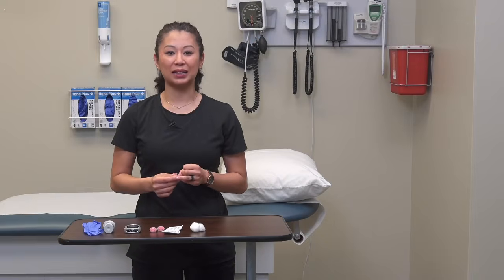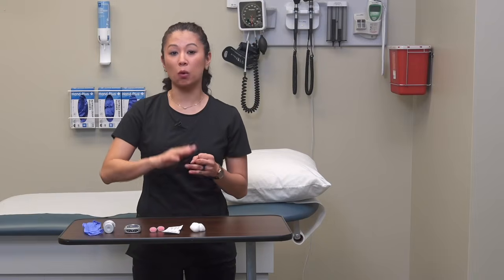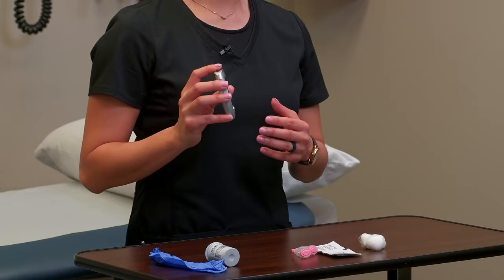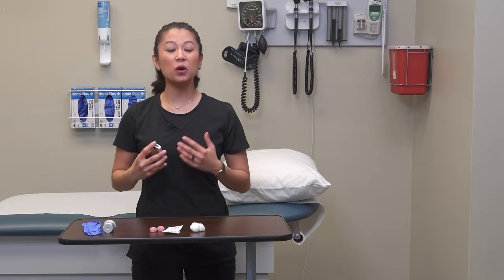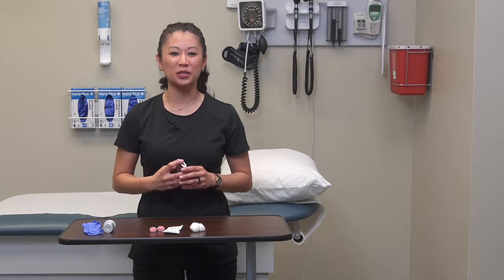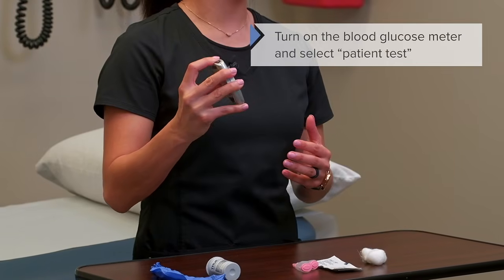If we need to dilate those capillaries, we can put a warm compress on there if needed. Now we have a home meter that I'm going to use to demonstrate, but I'm also going to talk you through the steps if we were using equipment that's widely used in acute care or the hospital, for example. So I'm going to go ahead and turn on my blood glucose meter.